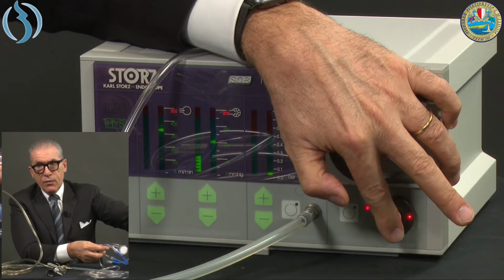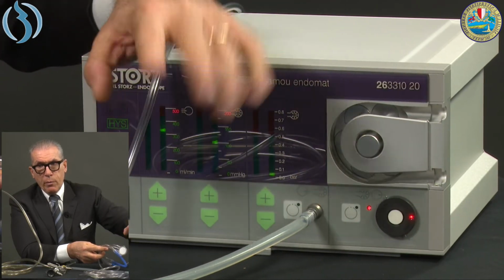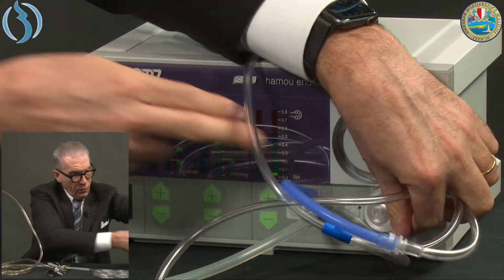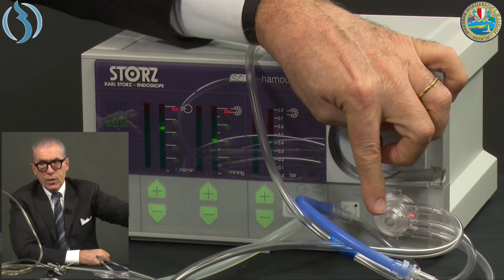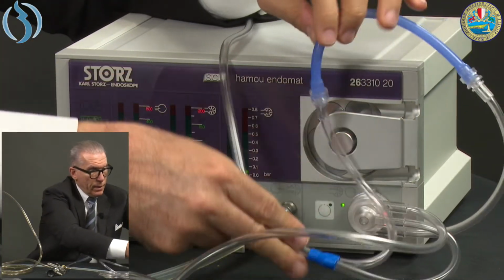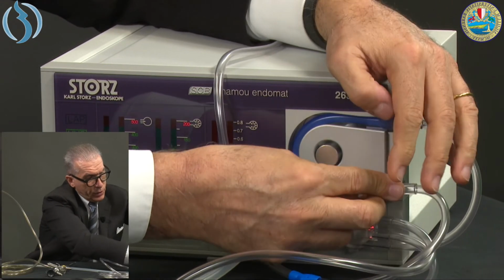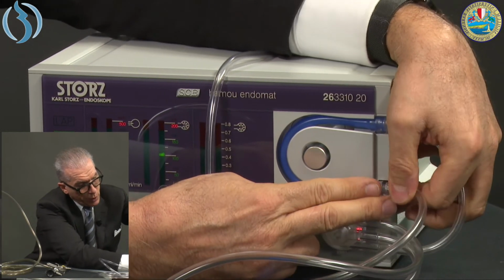The LED starts flashing. Imagine that instead of my fingers, you have the membrane, the dome of the membrane getting bigger, and it will assign an increased pressure inside the system. So we finally plug the dome into the pressure sensor. Then you have the blue tube here that is univocal in terms of position, so it goes only in one position, like this one. You cannot invert the insertion. This is because each tubing set is a part of the tube.